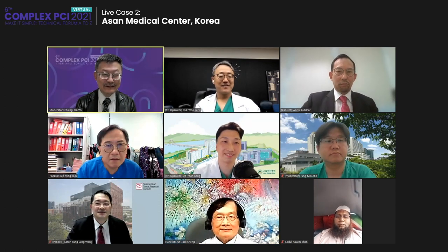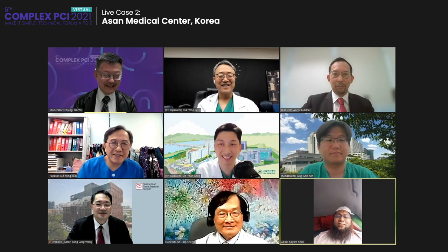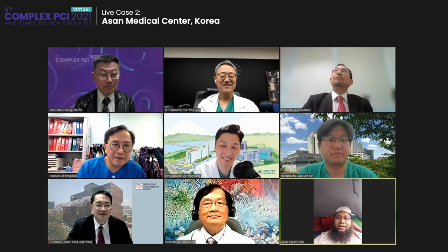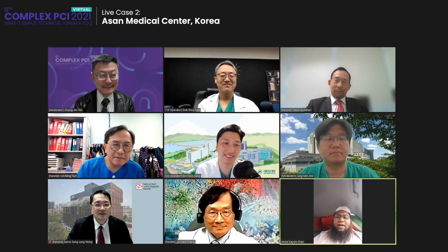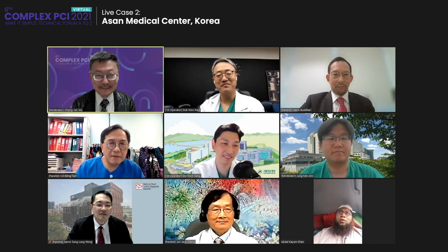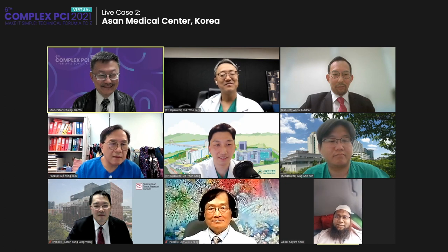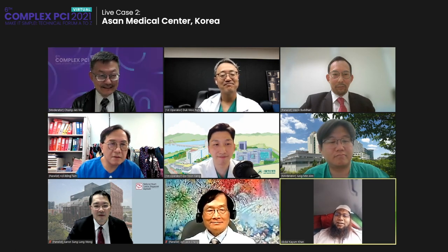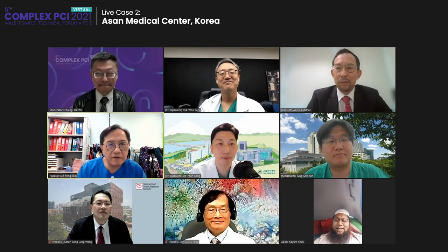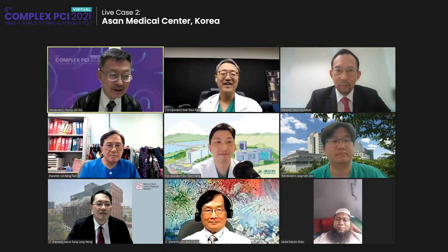Okay. Dr. Ken, maybe you can just close it because I guess our time is up. Thank you. We have a very good discussion. Very complex. I totally agree with you about putting another stent from the left main. It's a good option, better than the DEB. But I have a concern about the circumflex. Though the metal mass is increasing if you give another stent, there's a chance of restenosis again. So, is there any option for the circumflex? Maybe we can check the FFR in this case. It's a good option. Or maybe next time we can just cross the FFR wire over from left main to circumflex, a hybrid approach.